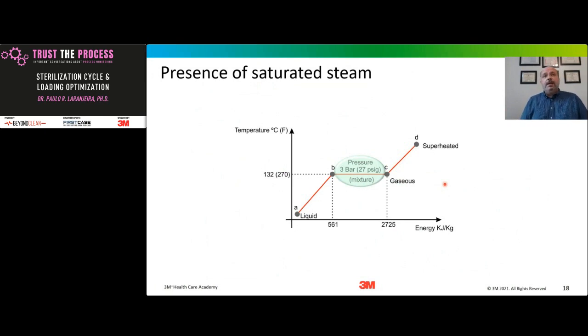I am just about to finish data collection related to superheated steam, and I should have that available by the end of the year. The evidence that we have is that superheated steam may be present in our current cycles. And if we have this condition, and you cannot see it because the equipment cannot measure it, superheated steam will not allow you to sterilize your load.